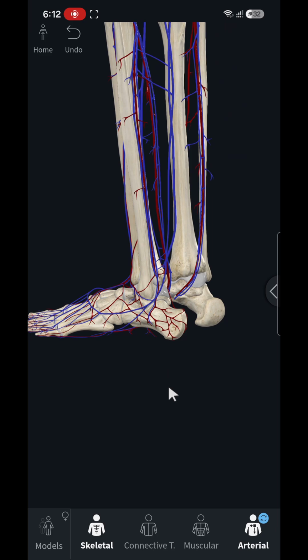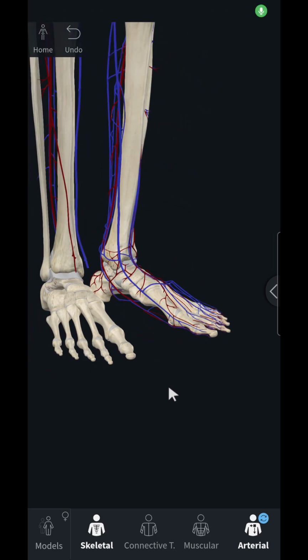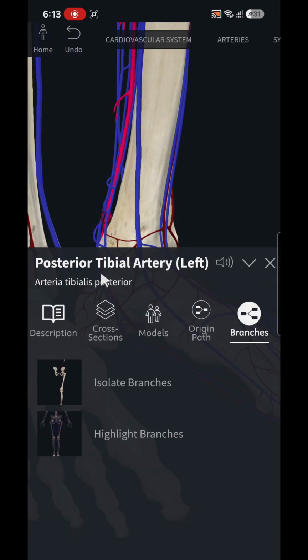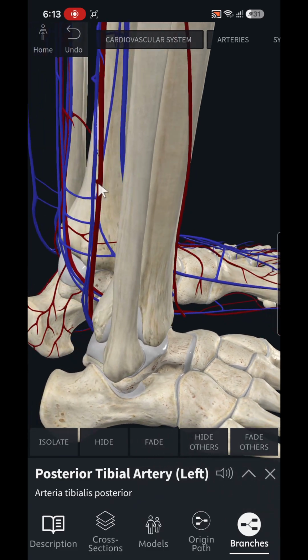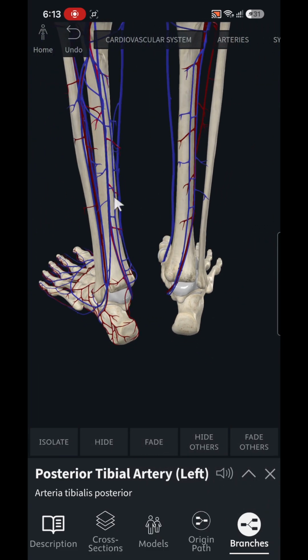And then looking for the posterior tibial, we place the probe TS again, right, below and posterior to the medial malleolus. So the medial malleolus, below and posterior, right? Here is the posterior tibial, right? And then we run alongside it. We try to view two structures congruent to it, which are going to be our veins along the calf muscles, right?